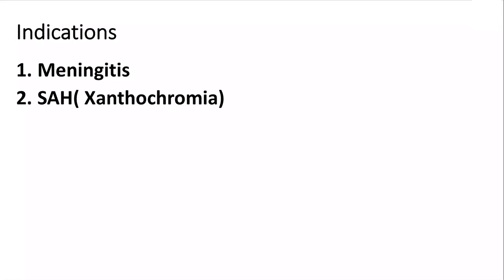Now coming to the indications, the standard one would be meningitis of various etiologies. It could be bacterial, viral or fungal. For subarachnoid hemorrhage, we have very good imaging techniques available. So for routine diagnosis of subarachnoid hemorrhage, you don't need a lumbar puncture.